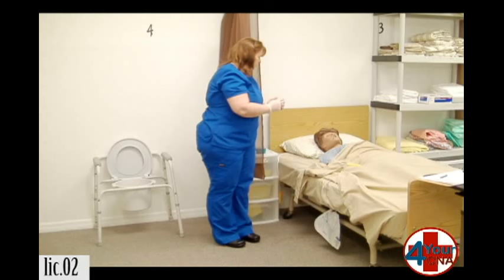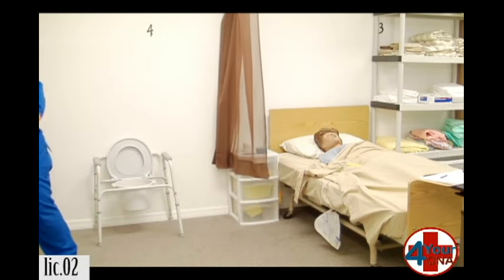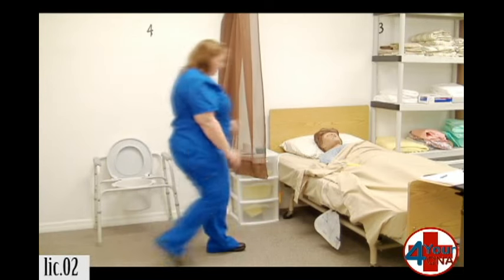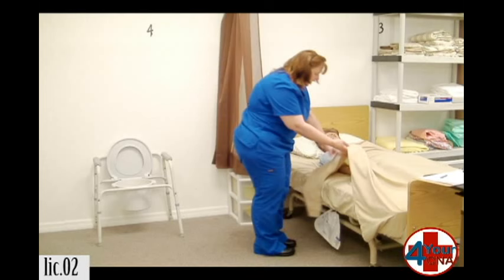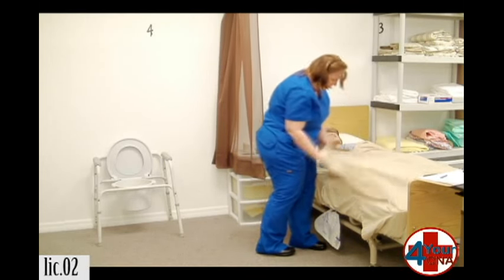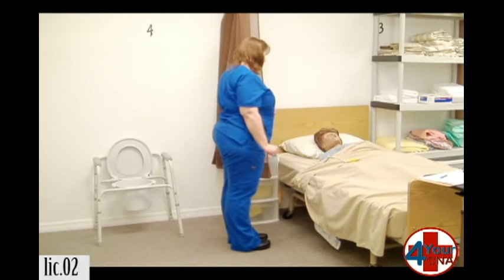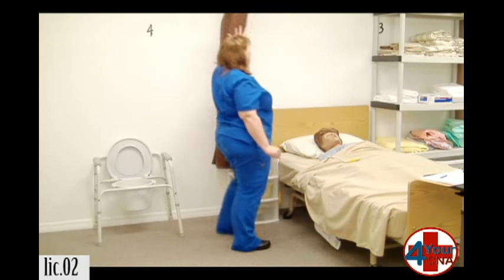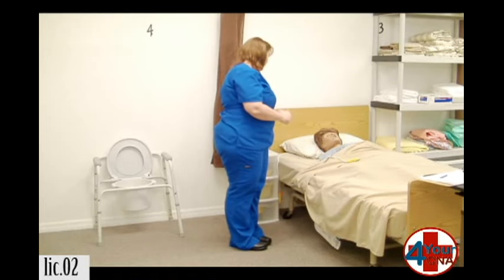I'm going to throw these away and remove my gloves. Okay, Ms. Jones, you doing okay? I'm just going to check your catheter out one last time — make sure the tubing looks good and you're not laying on it. Everything looks good. If you have your call light, is there anything else I can do for you while I'm here? I'm going to open your curtain and wash my hands.